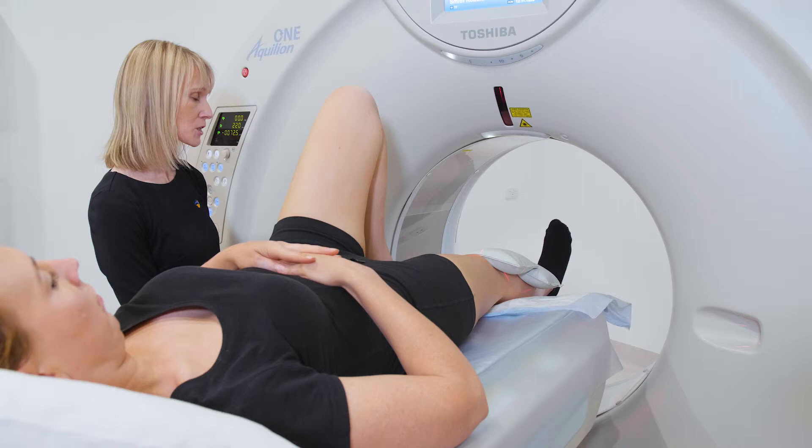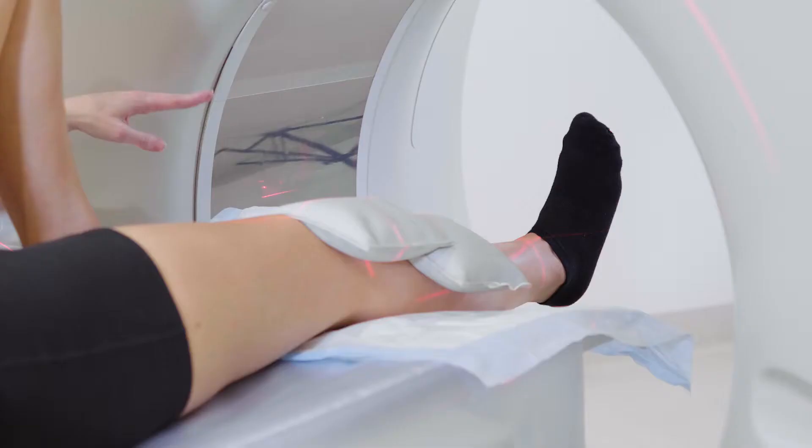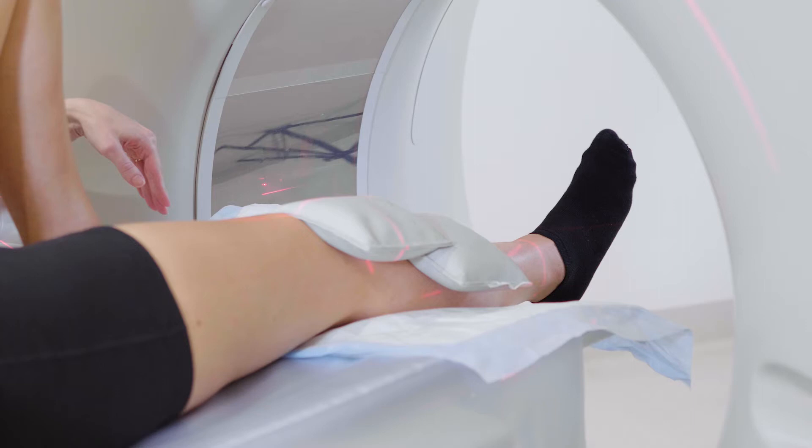We're going to start with flexion and we're going to count down. One, two, three, four — and then back up.